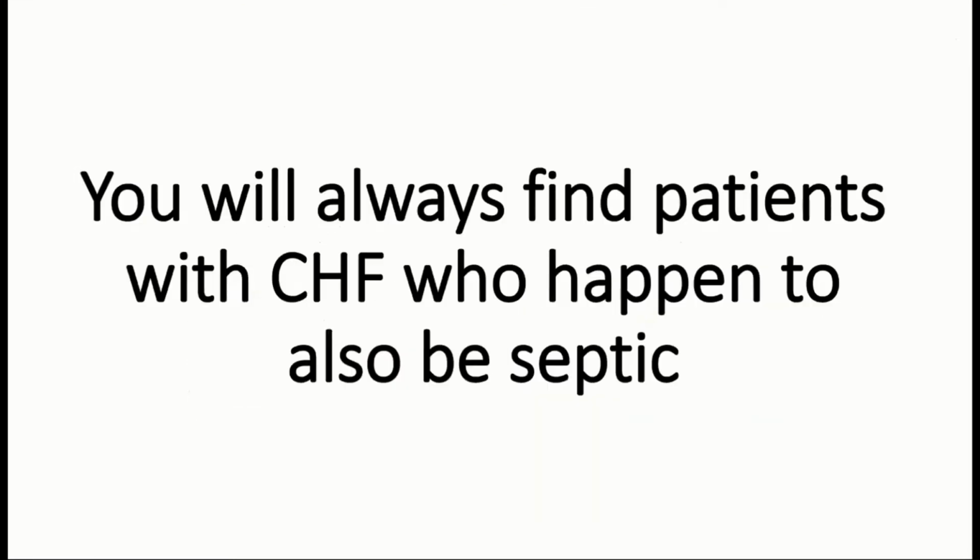So, as VExUS has been mainly studied in patients with heart failure, it's important to realize that you will always find this patient with congestive heart failure who will also happen to be septic. And I see no problem in using VExUS to evaluate venous congestion in this patient population.